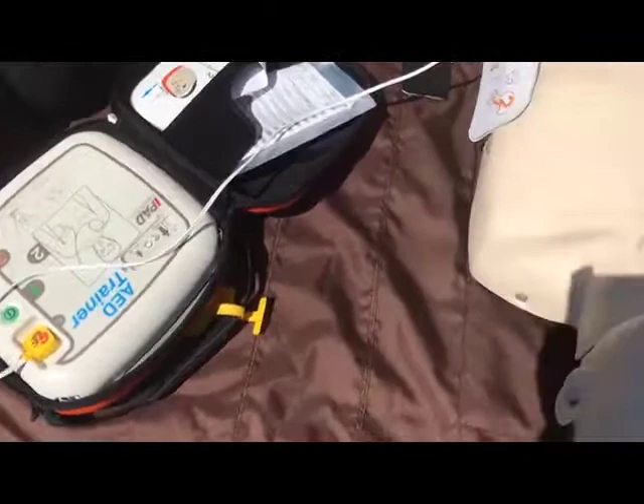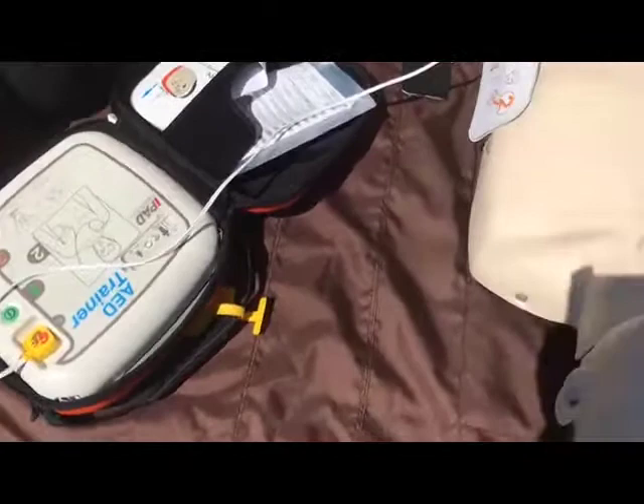Stephen, I'm going to shock — we're standing clear. We've pressed the flashing orange button and the shock is delivered. We're going back on the chest to do CPR again, and we will do this continuously until the ambulance comes.